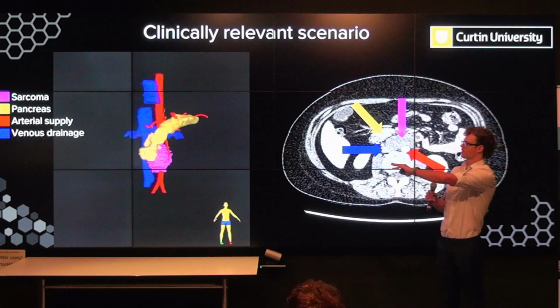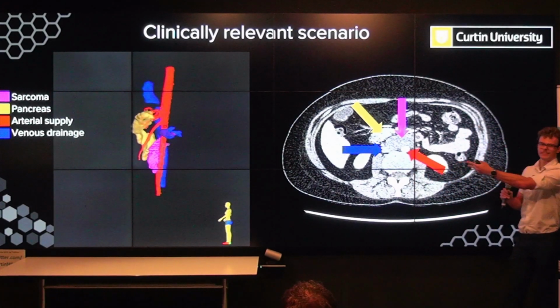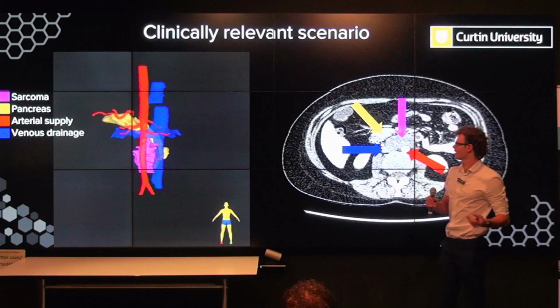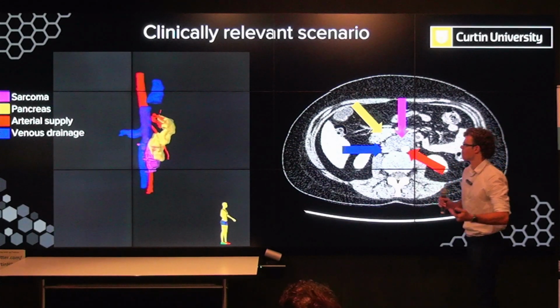Now, this shows a really good spatial relationship compared to the 2D axial slice, where the borders are pretty difficult to visualize. So would this be helpful in preoperative planning, knowing you can see how it looks in 3D, because people are 3D and not 2D? Crazy.